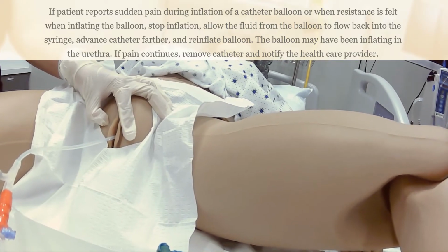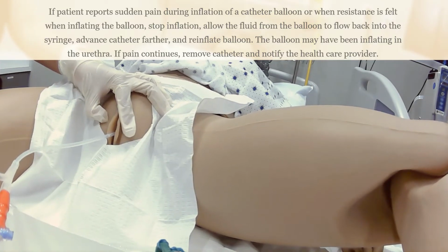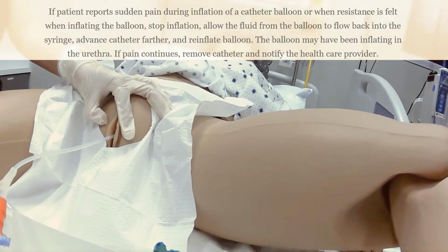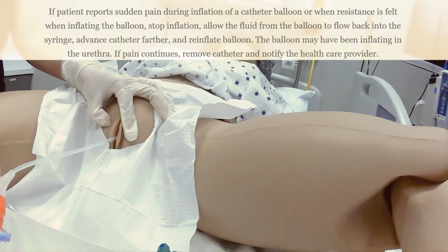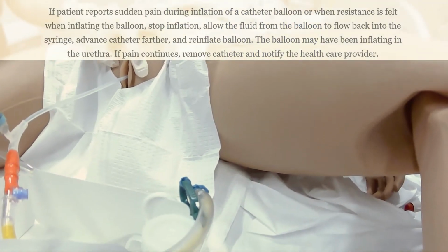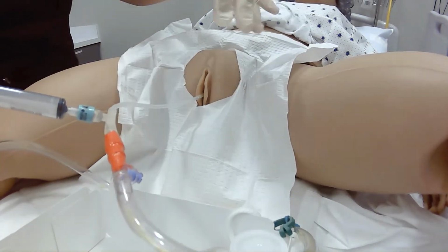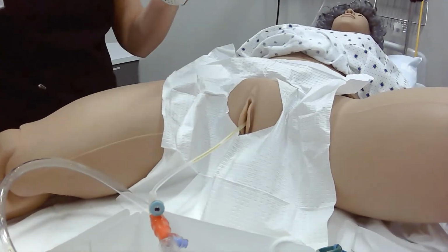Any pain or discomfort, Miss Adams? No. Do you feel any pressure or anything? No. Alright, so it's looking good. So I'm going to finish injecting all the water into that catheter tip. And now I don't need to be sterile or anything, so I'm going to remove it.